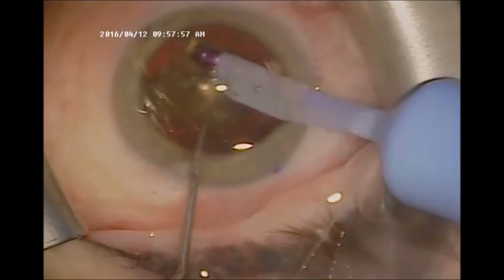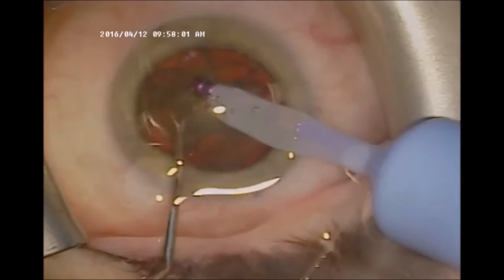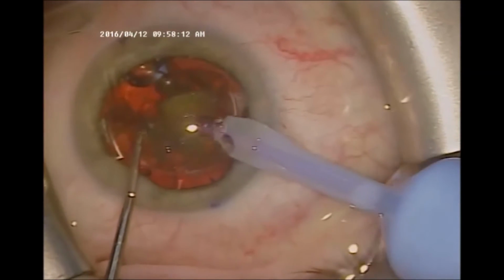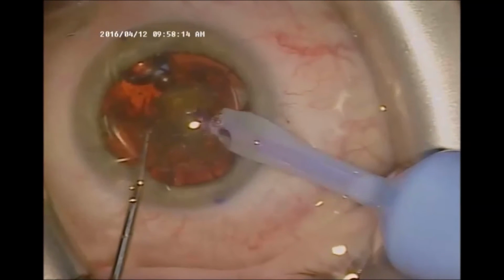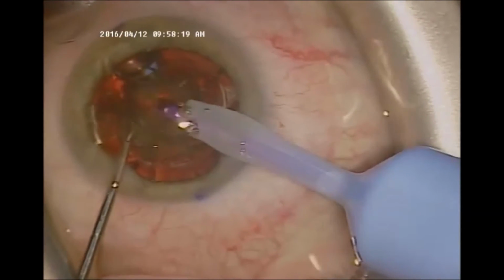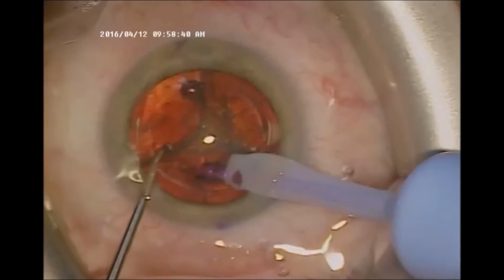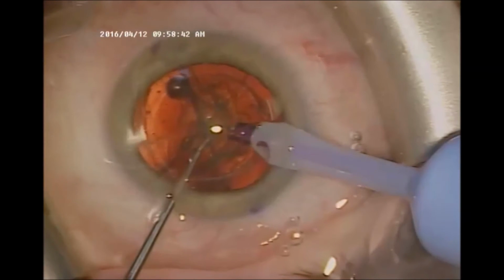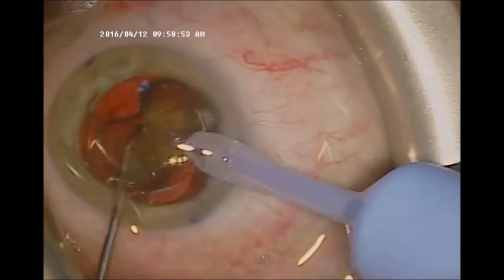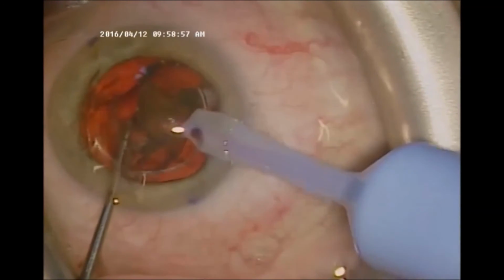And then I start to break the lens into smaller, more manageable pieces. And then I use the aspiration or the vacuum in order to remove the pieces. Here you can see one segment being removed and aspirated. And then we move on to a little bit later in the case, removing another segment. And here we rotate the lens, which has been freed from the capsule previously. Here we have yet another segment to remove.